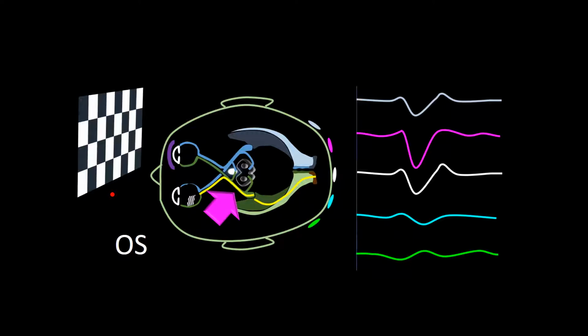After going through the chiasm but staying on the same side, these fibers travel in the optic tract and the optic radiations, leading to activation of the visual cortex of the left hemisphere. This activation will produce a field with the main force of the vector pointing to the opposite side, that is towards the right occipital, mid-occipital, or right temporal electrodes.